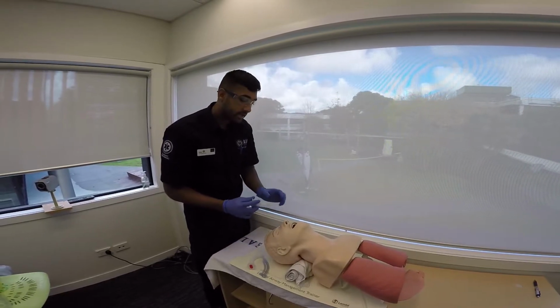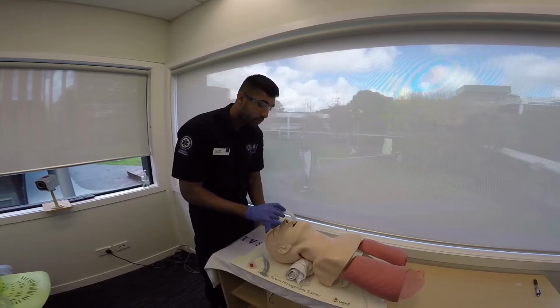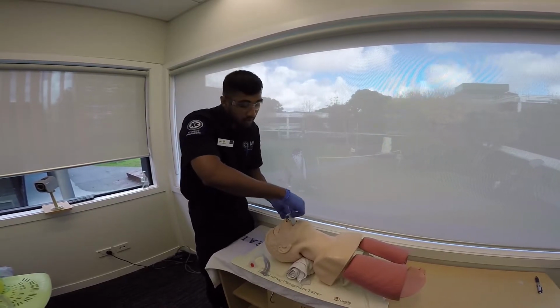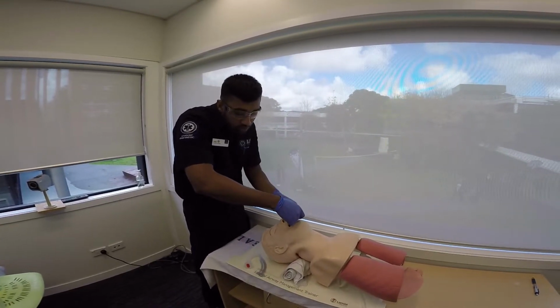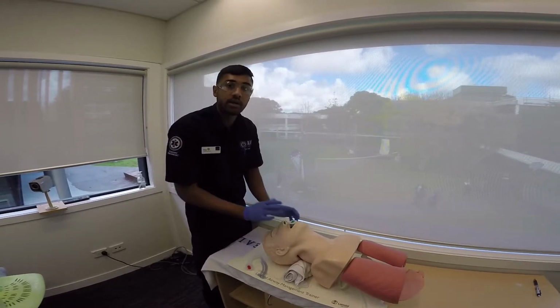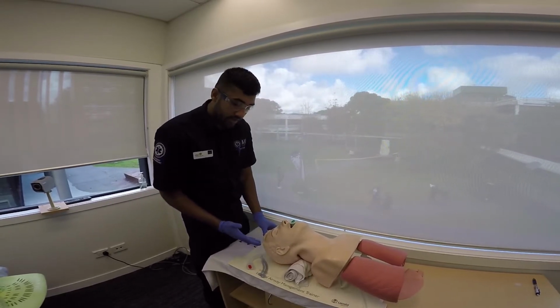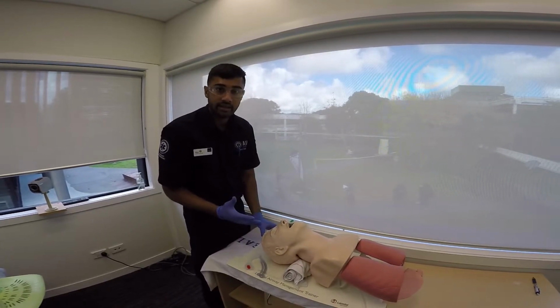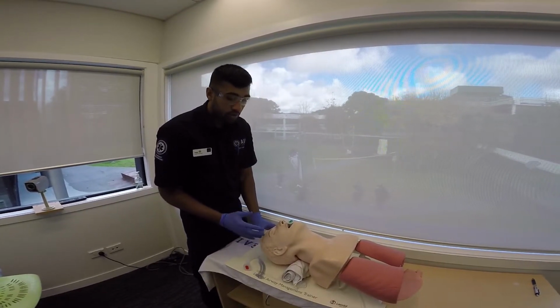And when putting it inside the patient's mouth, you want to invert it, putting it towards the roof of his or her mouth, and inverting it, doing a 180 degree turn so it sits just behind the patient's tongue. What this does is it sits between the teeth, preventing the jaw from clenching, and it acts like a bite block, and it also maintains an open airway.